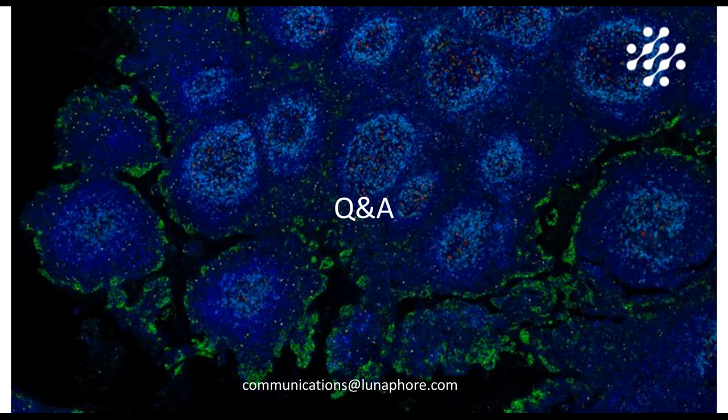Thank you so much. Now, could TSA be used for colocalization analysis? Yeah, so in this type of assays, or at least with what we could see on LabSat Research, it's an interesting technique for that. First, because you can detect multiple markers at a time. Also, because you can achieve subcellular precision.